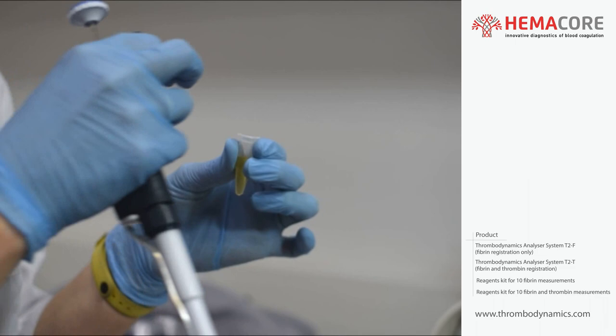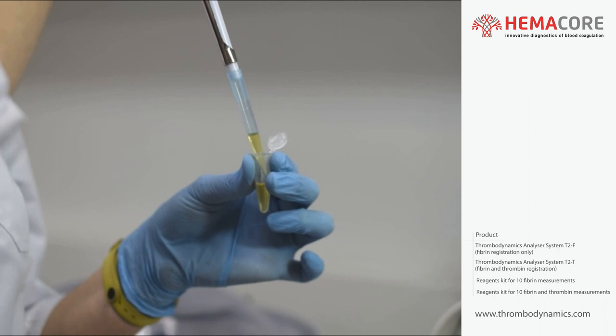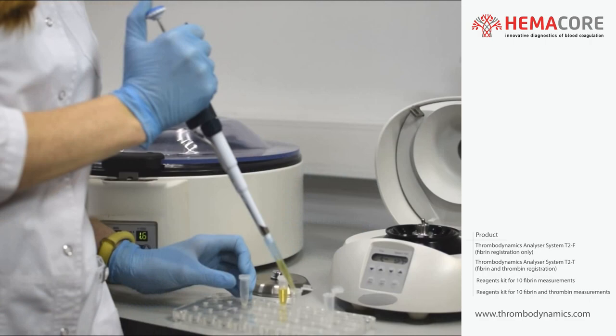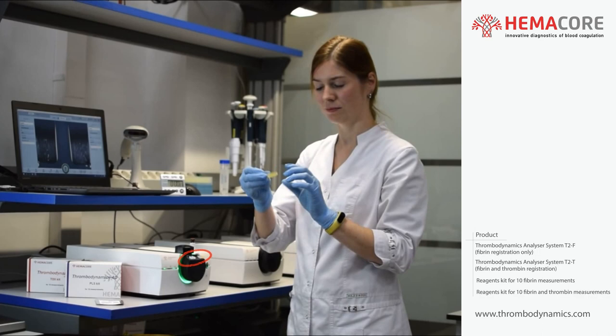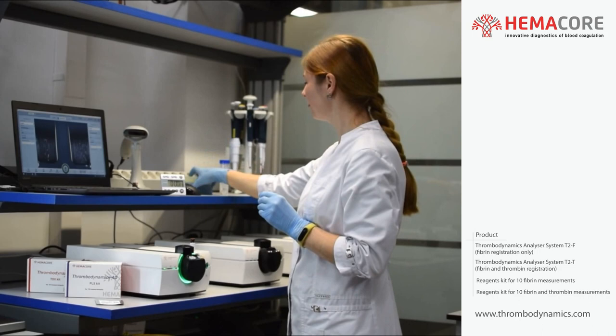Transfer 90% of the specimen liquid volume from the upper platelet-free plasma layer to a new tube, leaving any erythrocyte and platelet pellets at the bottom. Platelet-free plasma specimen should be used within 4 hours after blood collection. Take reagent chips from the TDX kit and PLS kit and place them into the preheated places on the thermostat.